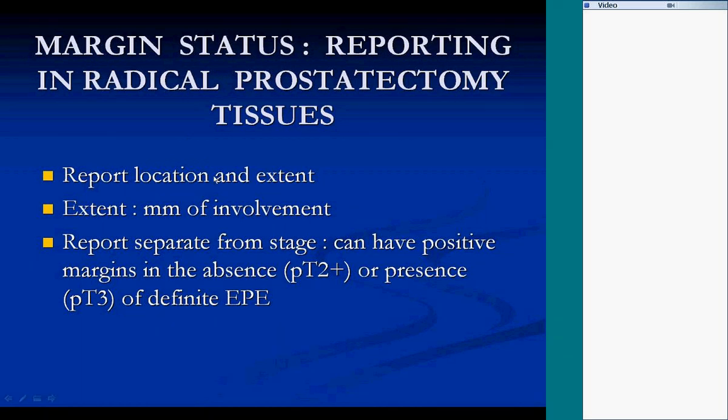So again, report location and extent. Something that is new in the CAP protocol and at the ISUP meeting is the recommendation to report the amount of margin involvement as linear millimeters. This is relatively new, and I think we'll be seeing some data coming out as to whether this is going to stand the test of time. But for now, it's a way to quantitate in numerical terms the amount of cancer at the margin.